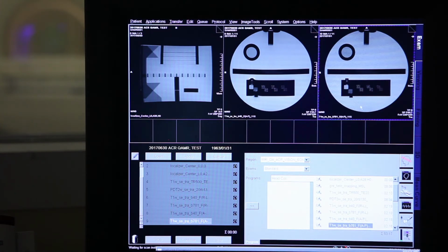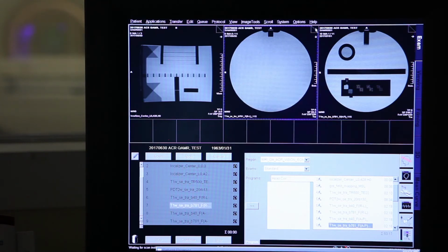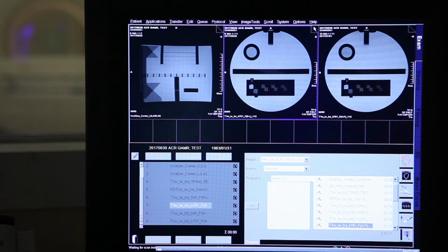So if you're going to use the system for radiotherapy purposes, you have to use sequences with higher bandwidths, because of susceptibility artifacts from metal. For metals, exactly, prosthesis and all those things work correctly. They really work nice. So this image and the previous one, the high bandwidth image, should look the same, although we changed the gradients. They are the same. Why would they be different?